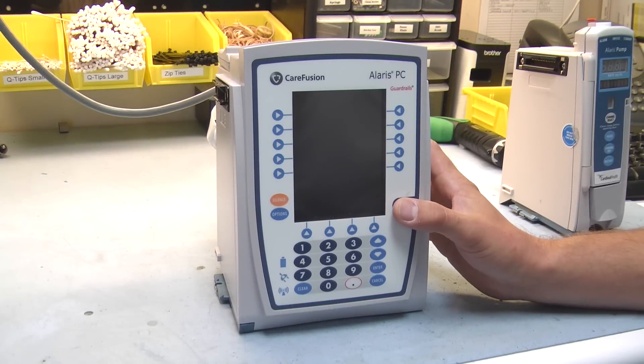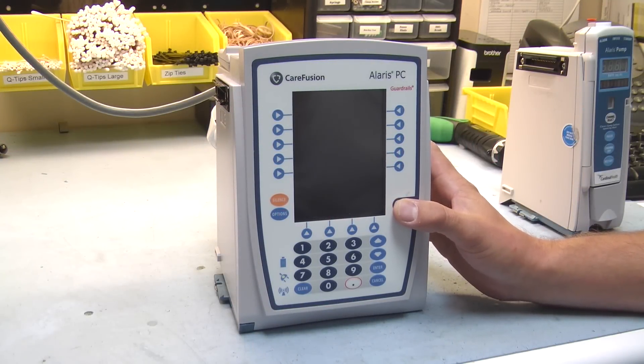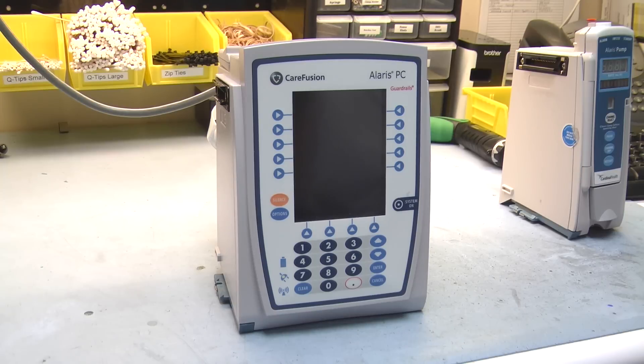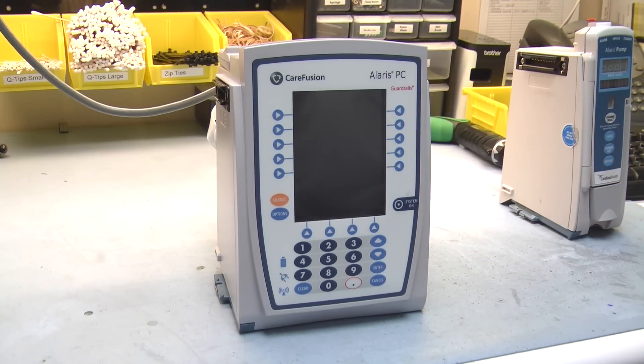My name is Ian Black, Lead Biomed here at MedOne. Today we're going to be talking about the Carefusion Alaris system — the PC unit, also known as the Brain. This model is the 8015 with the color display. I'll be walking through the configuration of it and how to change clinical settings on it.